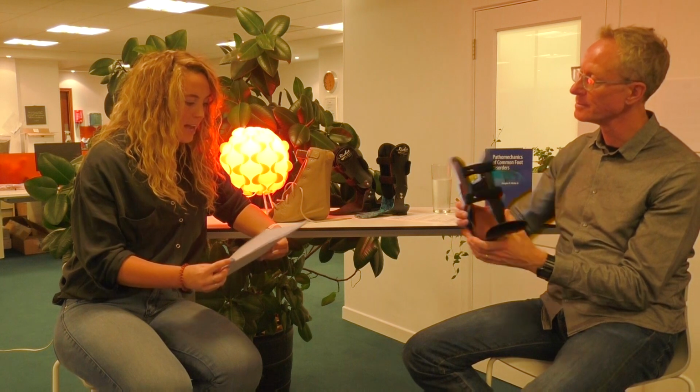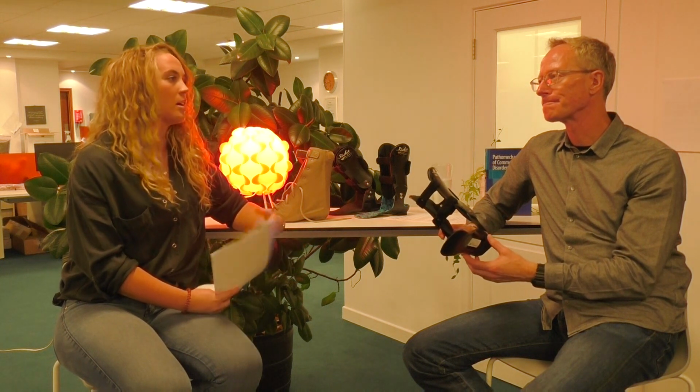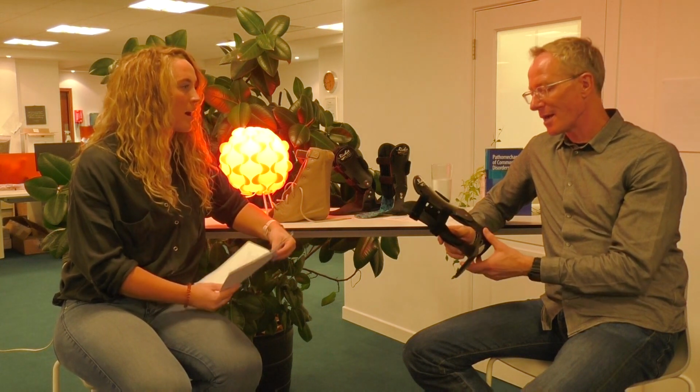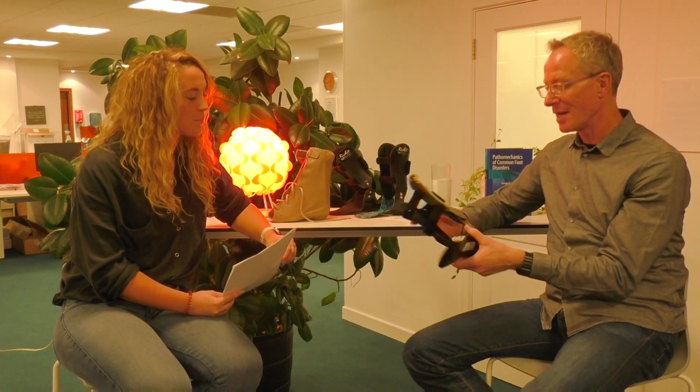Perfect. And then what footwear does it suit? So are there specific footwear considerations? Are there limitations? When you're dealing with a product like this that has a 35mm heel cup, you're really looking at athletic footwear. And I remember initially when I started prescribing them, the Brooks Beast was the recommended runner at the time. But many training style athletic footwear, it will fit.